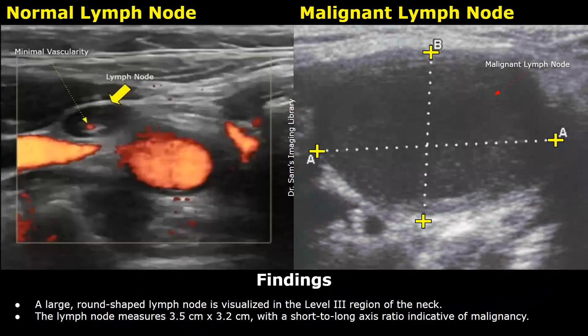Here is another example of a malignant lymph node and its report. These are the findings: a large, round-shaped lymph node is visualized in the level 3 region of the neck. The lymph node measures 3.5 by 3.2 centimeters, with a short-to-long axis ratio indicative of malignancy.